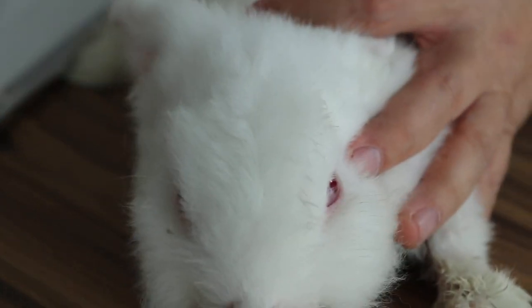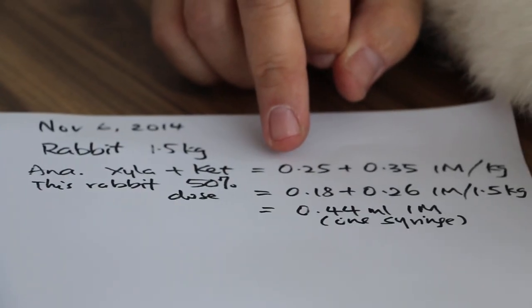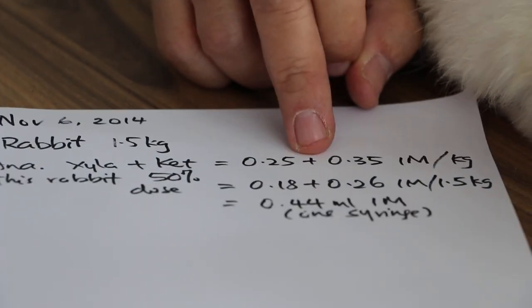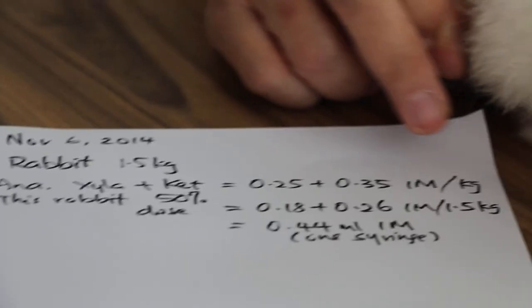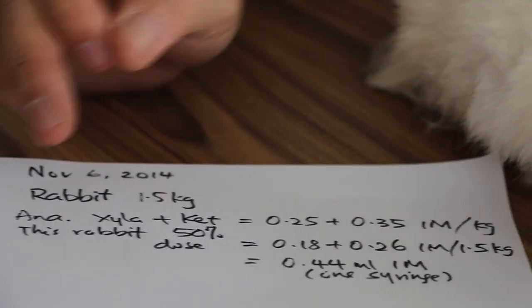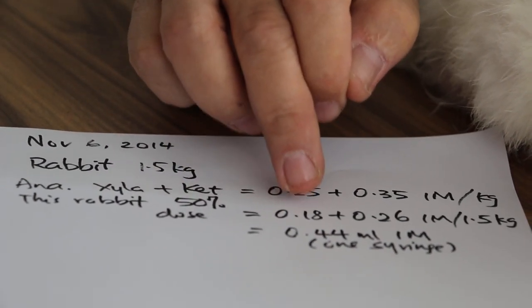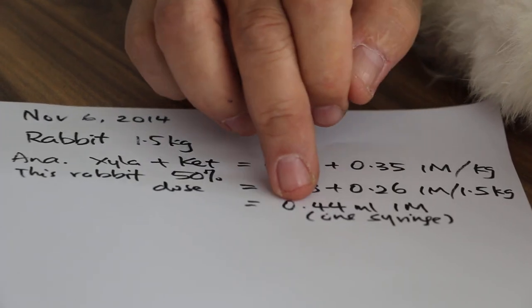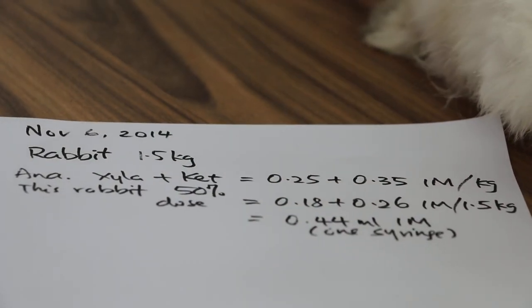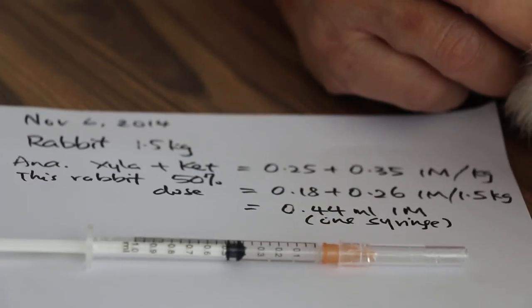So after sedation — which we use for rabbits, the formula is: xylazine plus ketamine, 0.25 plus 0.35 ml in one syringe IM per kg. Now for this rabbit, which is quite thin at 1.5 kg, I'm using 0.18 plus 0.26 ml IM — total 0.44 ml IM in one syringe. That will be 50%.